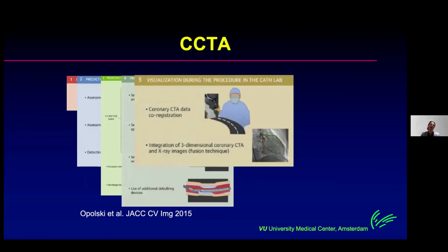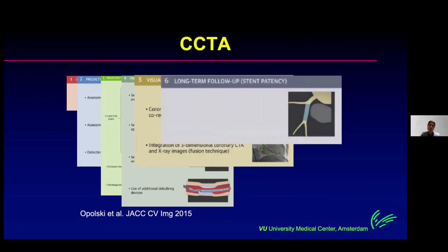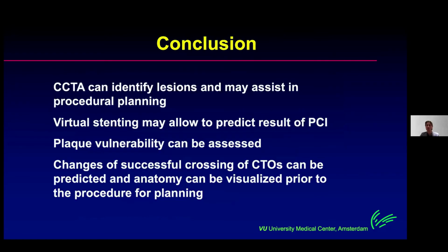And after the procedure is ended, in the years to come, you can do CT coronary angiography again to assess stent patency, or whether they did bypass surgery, graft patency. So long-term follow-up is important.